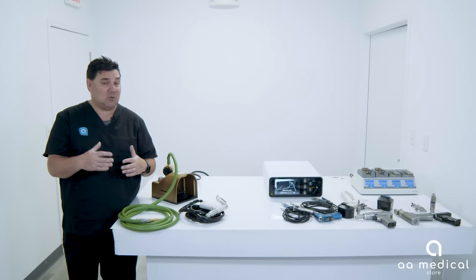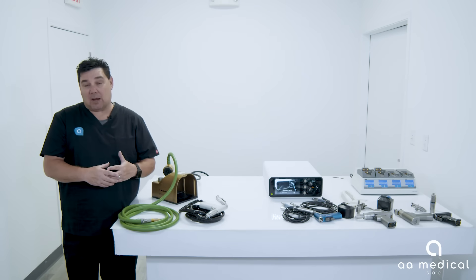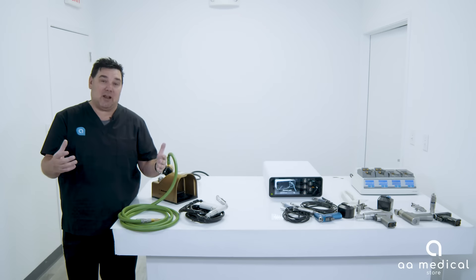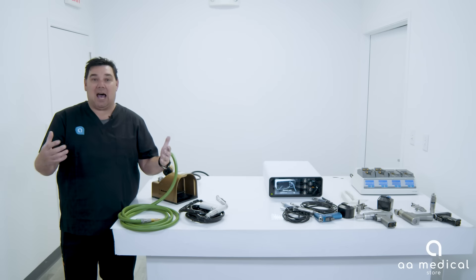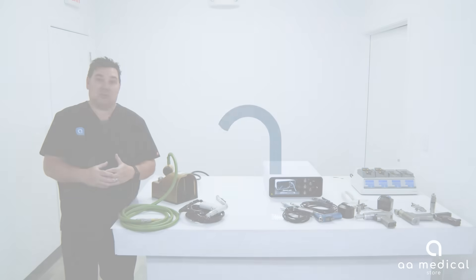For this demonstration we used the Midas Rex and the Hall system, but Stryker makes one, Conmed makes one, and all other manufacturers make a nitrogen or pneumatic powered system. It really just depends on what's best for you and what's best for the facility.